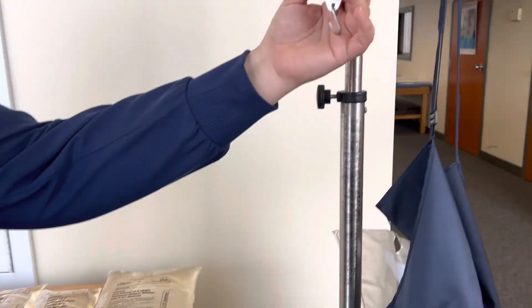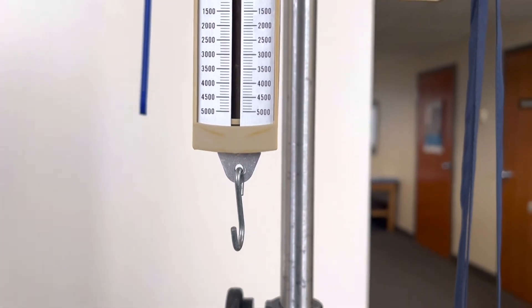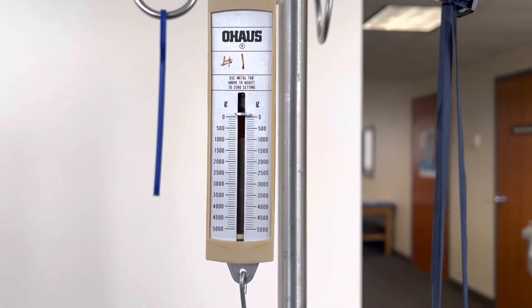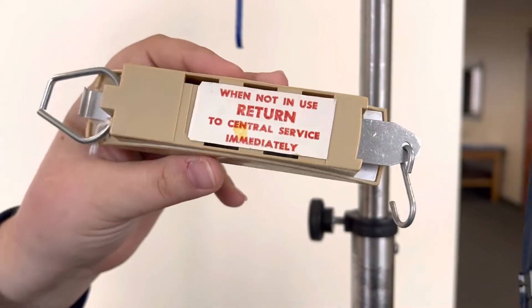The only other thing that you're going to need is this scale, which we will use when we do the exchange to measure and weigh the amount of output that the patient will have with the dialysis solution. You can get this scale from central supply.